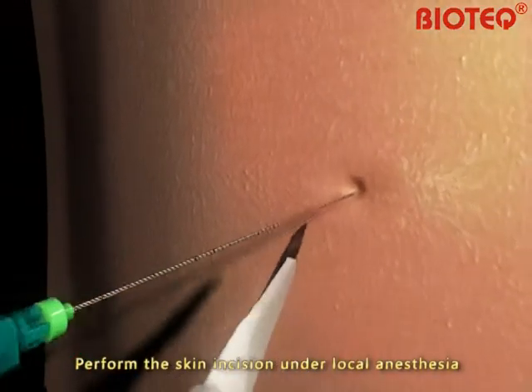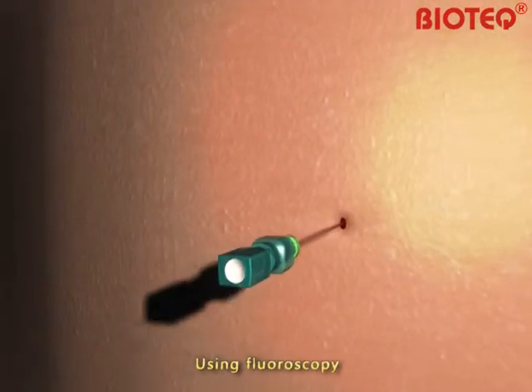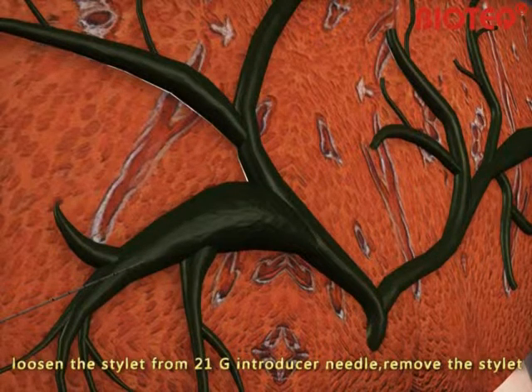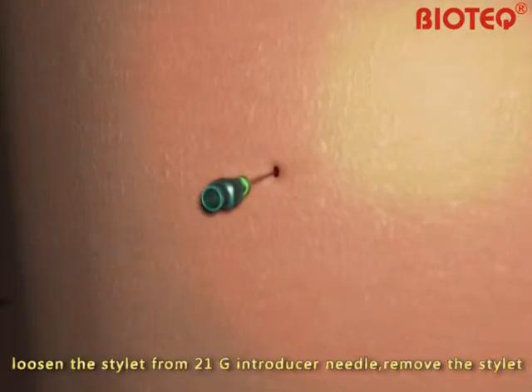Perform the skin incision under local anesthesia. Using fluoroscopy, the 21-gauge introducer needle is advanced into the biliary tract. Loosen the stylet from the 21-gauge introducer needle and remove the stylet.